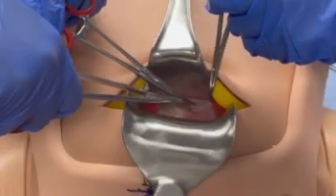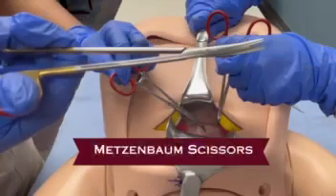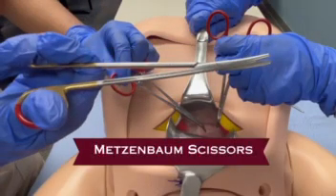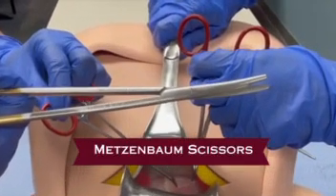The peritoneum is incised using Metzenbaum scissors. Metzenbaum scissors are the other main type of surgical scissors. The fine, curved blade of Metzenbaums are used for precise dissection in delicate tissue.